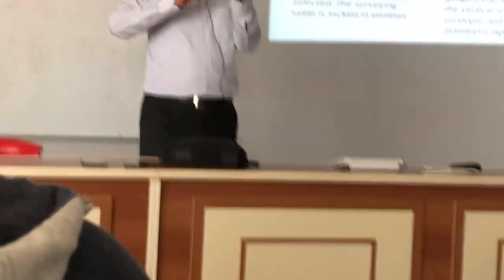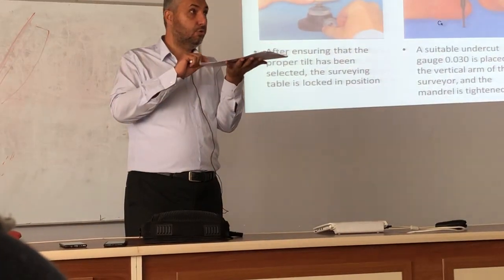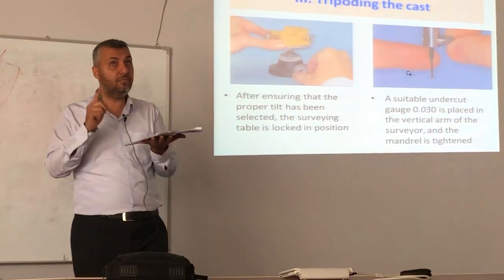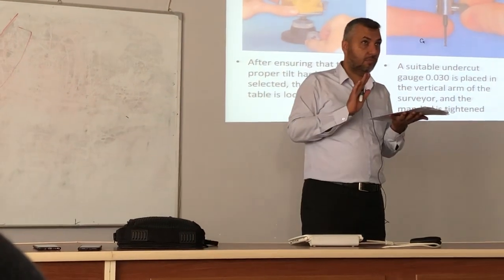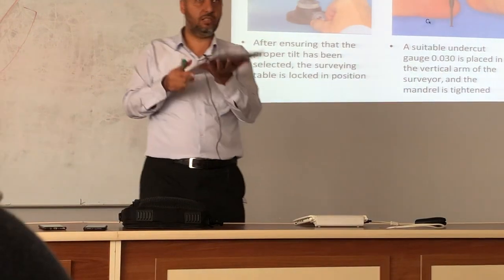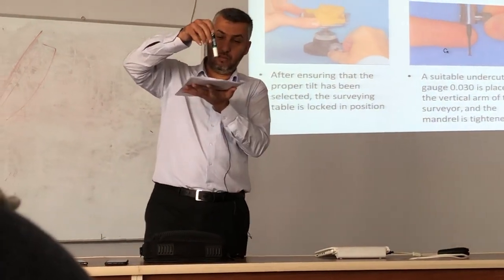I choose the most desirable tilt, because tripoding is done after choosing the most desirable tilt. After choosing it, by this marker I make 3 points.